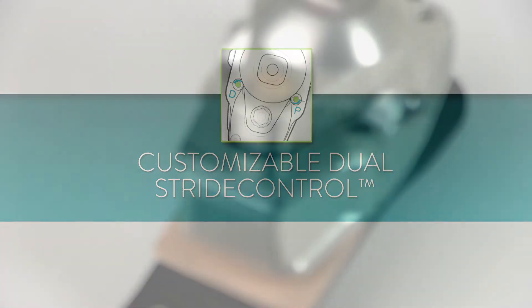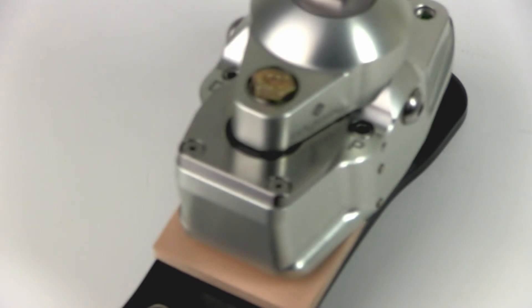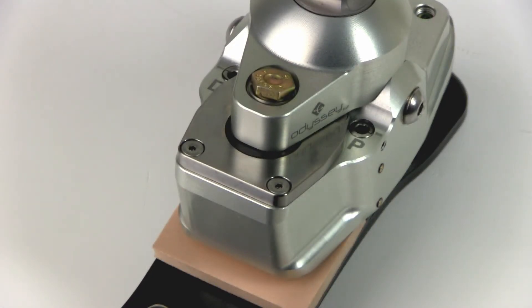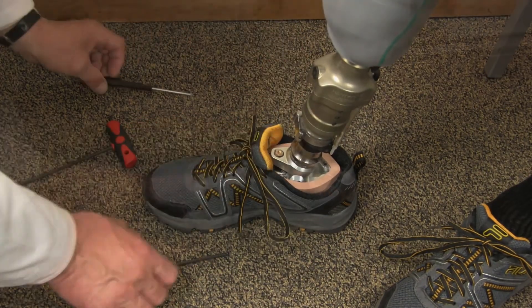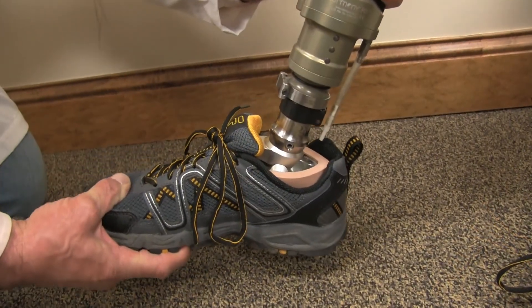The Odyssey K2 has independently adjustable plantar and dorsiflexion valves for in-office tuning. Two adjustment valves provide a wide band of resistance control for on-the-spot customization, optimizing energy return and improving gait.